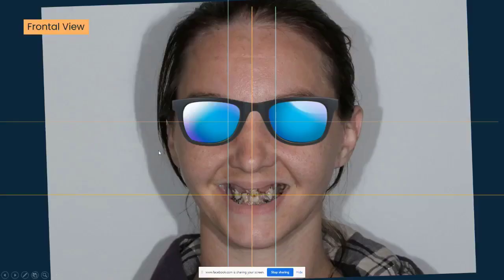And then we got her in and gathered all the diagnostic data, right? So that was the first time we saw her. We're going to get a CT scan because we're going to do implant rehabs on her. So CT scan, intraoral scans of her teeth. Then facial pictures, to me, those are non-negotiable. I absolutely will not do a full mouth case or even an aesthetic case without good pictures. And I primarily want full face smiling, full face at repose, and then a lateral view of the same. Okay, and we'll go through how I utilize those. But for me, pictures are non-negotiable.